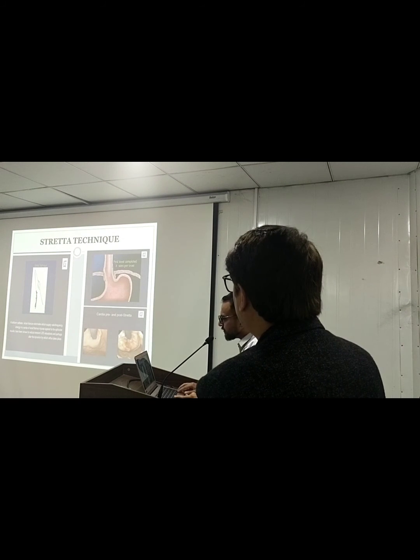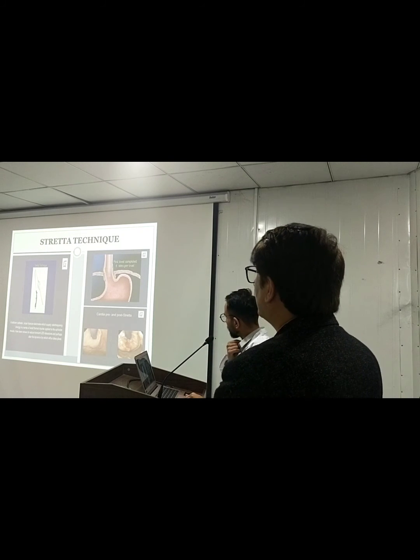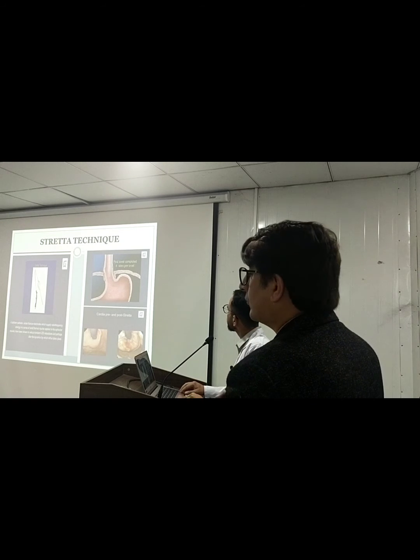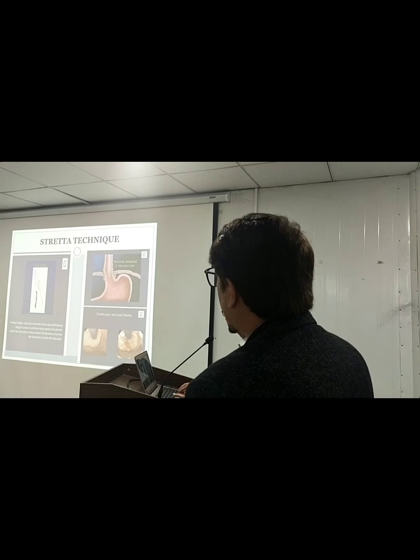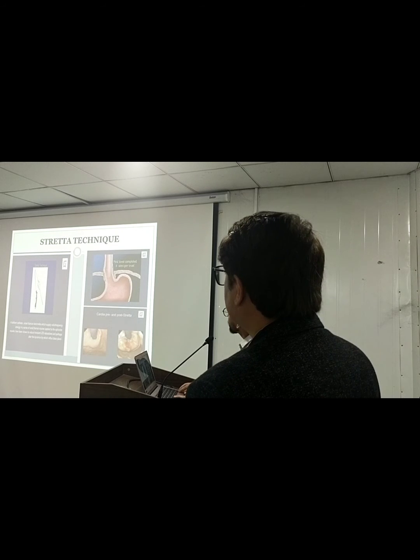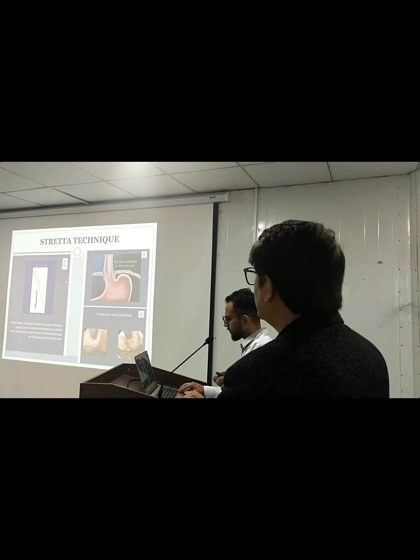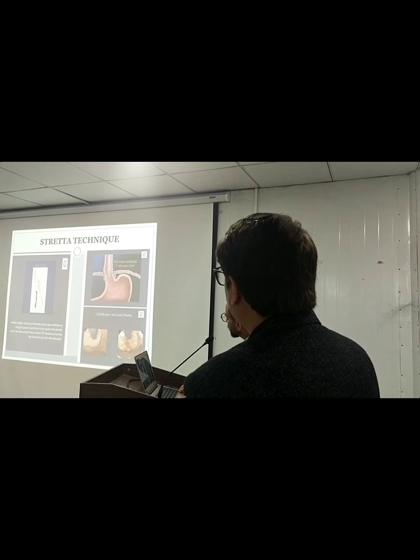Stretta technique. Stretta is basically a technique that delivers radio frequency waves to the gastroesophageal junction. This is the device. Actually it's a balloon attached with electrodes, through which we supply radio frequency energy in a series of small thermal injuries to the lower esophageal sphincter to reduce transient LES relaxation and perhaps alter the dynamics by which reflux takes place. So through this technique we can control reflux esophagitis.